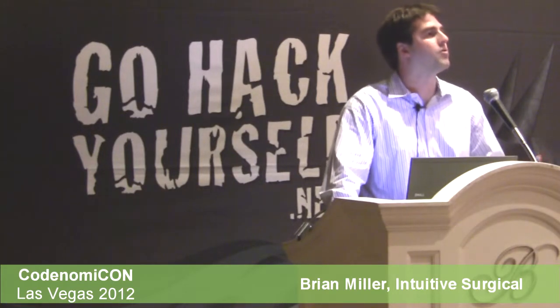And then also some remote mentoring and proctoring capabilities as surgeons are coming up the learning curve. It's valuable and it's standard practice right now for an expert surgeon to mentor or proctor the surgeon through their training pathway or through their learning curve.